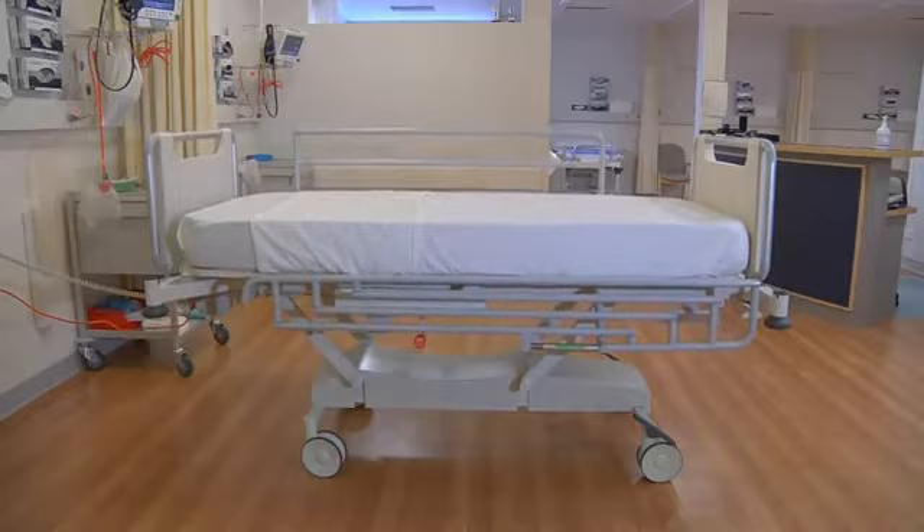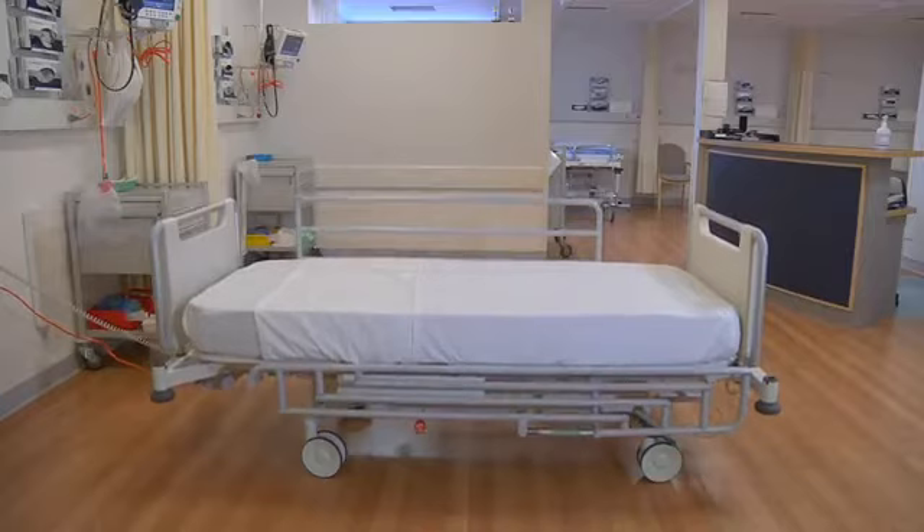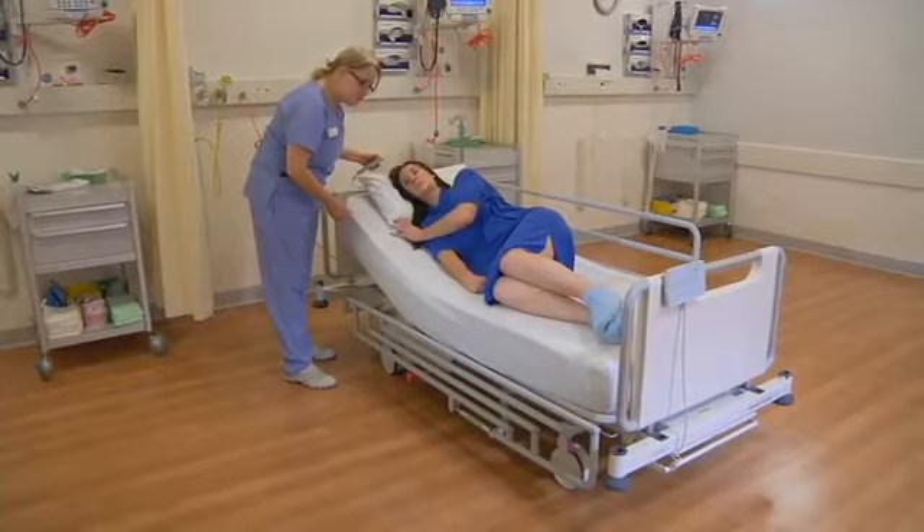With a redesigned bogey and the addition of more powerful electric actuators, the M9 can be raised as high as 800 millimetres, but also lowered to just 350 millimetres, making patient entry and egress far safer and far easier.